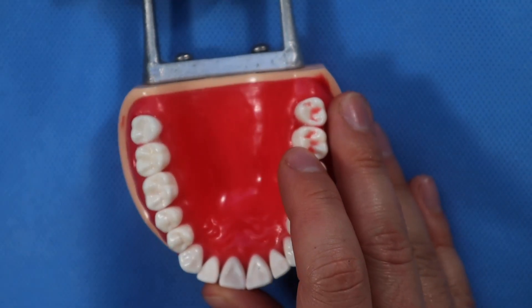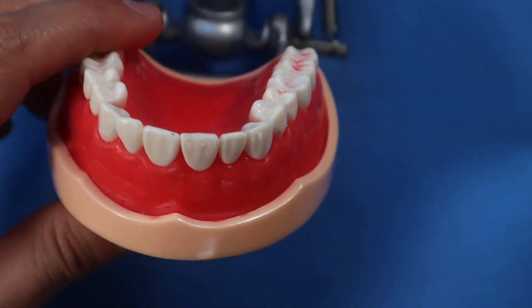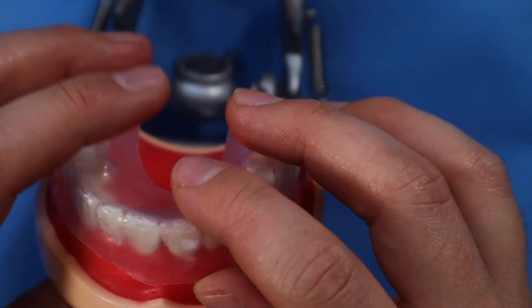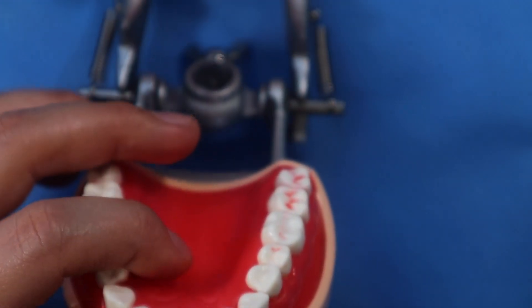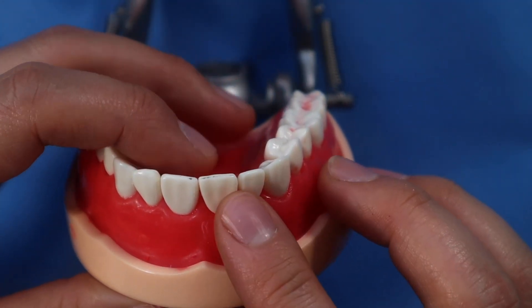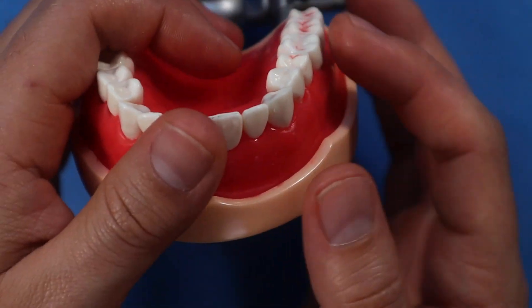There are basically two ways to do an immediate temporary. One way is to use a vacuform splint as a template to make your temporary. The other way is to use the tooth itself as a temporary — I'll show you that way, using the tooth itself to help be the provisional.